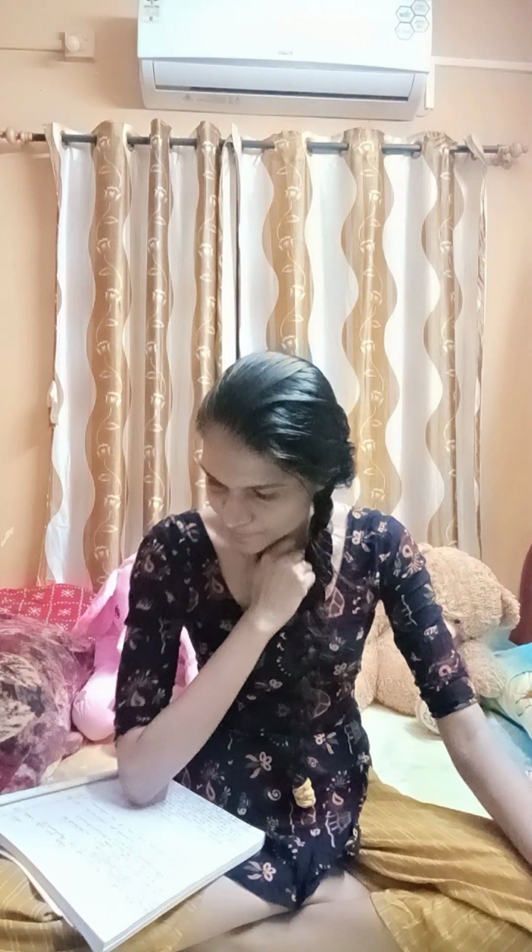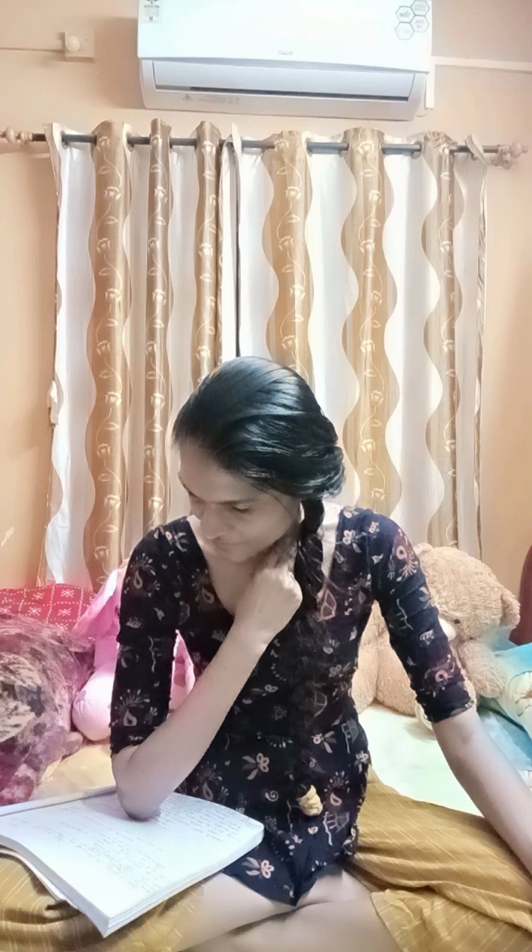And what are the uses of this test? It has diagnostic and prognostic value. So diagnosis of the type of squint: whether paralytic, whether comitant or incomitant, whether horizontal or vertical tropias. Then second, whether it is paralytic or restrictive. So these are the diagnostic uses. And if it is a paralytic squint, the chart will obey Hering's law of equal innervation and Sherrington's law of reciprocal inhibition.